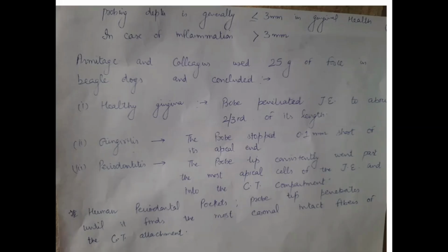In case of gingivitis, the same probe with 25 grams of force stopped 0.1 mm short of the apical end of the junctional epithelium. But when there was periodontitis, the same probe with the same force consistently went past the most apical cells of the junctional epithelium, and it went into the connective tissue compartment. It means that as the inflammation increases, the probe tip penetration goes deeper into the connective tissue. The reason is very simple. When the gingiva is healthy, connective tissue is more fibrous, and the fibers of the connective tissue resist the penetration of the probe.